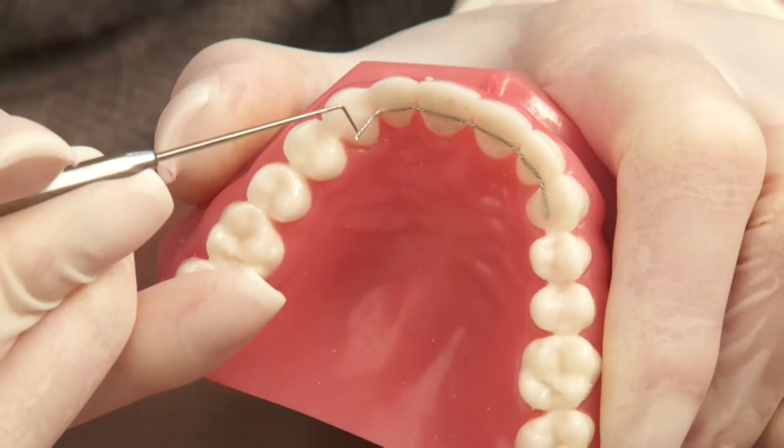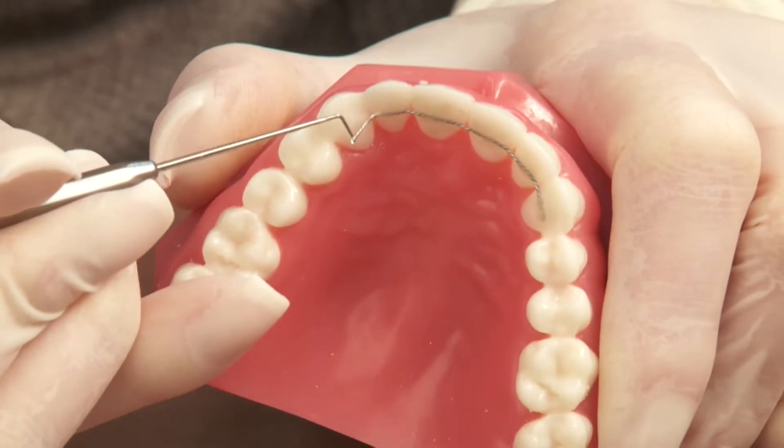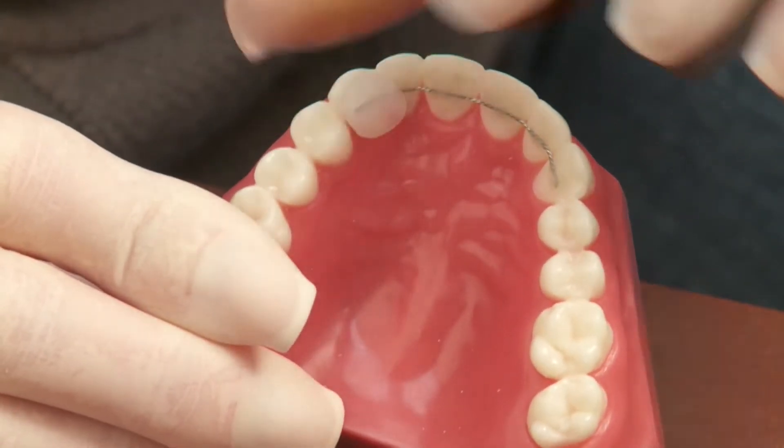On the rare occasion that your bonded or permanent retainer is poking you, just call our office to schedule an appointment to be seen as soon as possible. In the meantime, you may be able to place wax over the sharp area of the retainer to make yourself more comfortable.